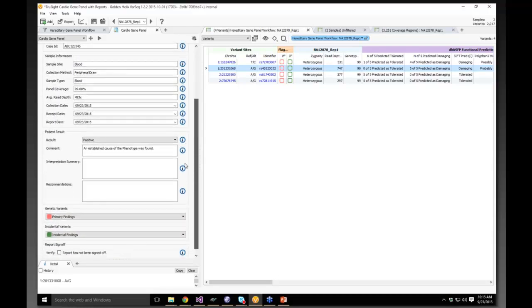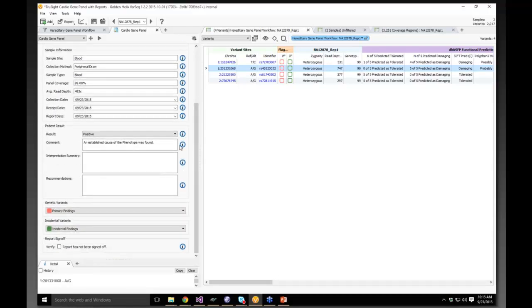So in this case, we need to then, and this is the critical interface of the hands-on human experience, say which of these variants do I put in my report, and what's the final result? Is it a negative finding? No variants conclusively supported it. Notice we can actually have report components be responsive to the input here. So let's say we find this to be a primary finding.